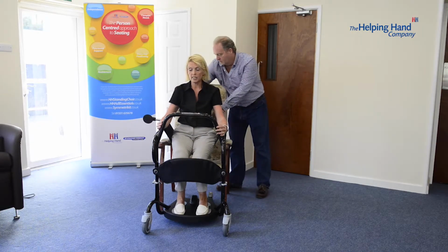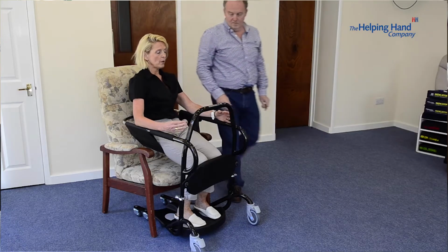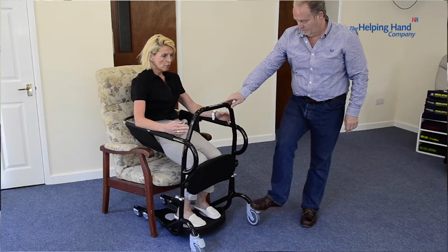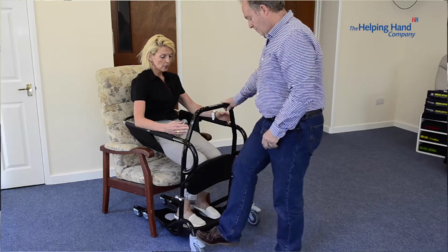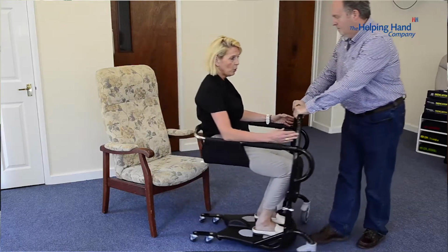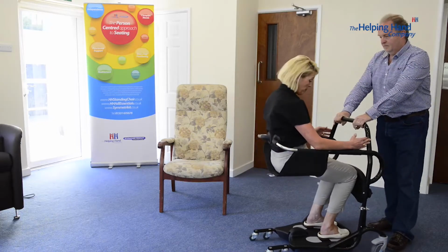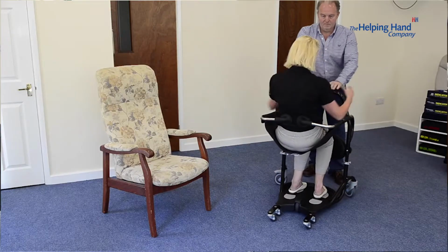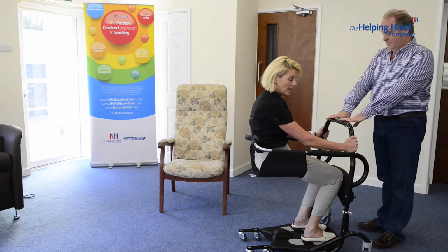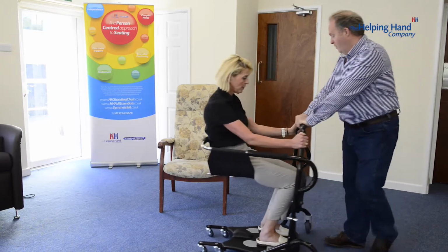And then once the client's seated, leaning forward gently to put the knee pads and back paddles on to stop me from falling out. Release the brakes, and then gently pull away. You can see from the side here, nicely seated, feet firmly planted, supported from behind, supported around. And as we go through doorways, making sure we keep our hands on the inside, not on the outside. Pop them back.